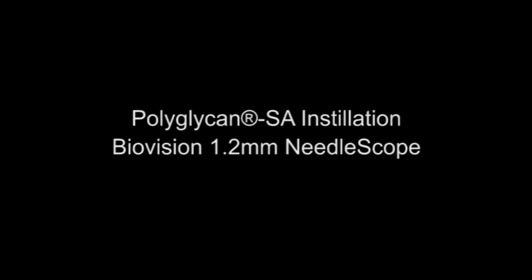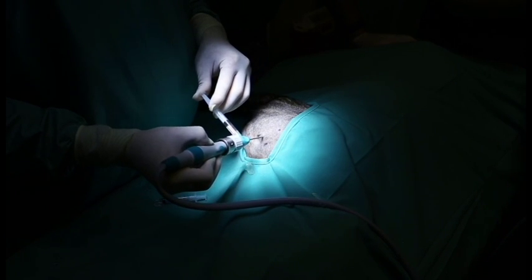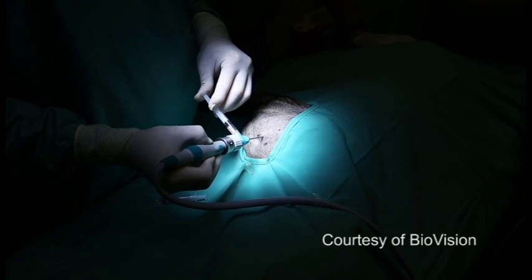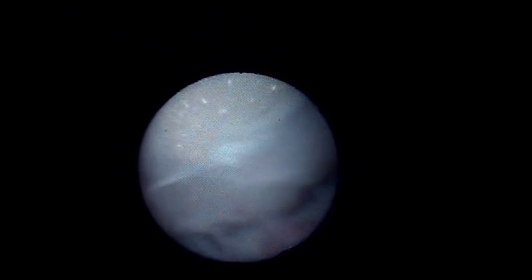Microinvasive arthroscopy for diagnostic and therapeutic joint procedures is available for use in companion animals. The 1.2 millimeter needle view orthoscope by BioVision is a breakthrough in technology, providing practitioners more potential expansion into joint therapy with a compact and portable all-digital arthroscopic system.